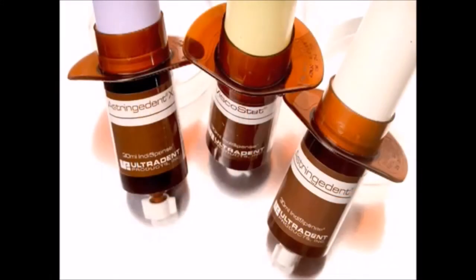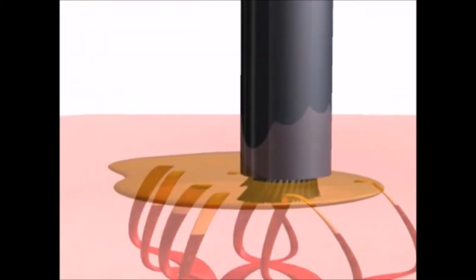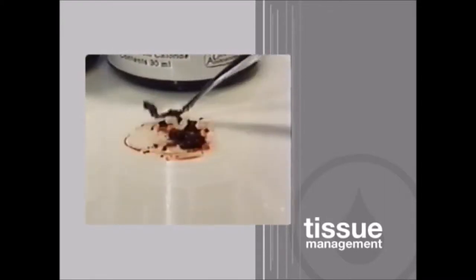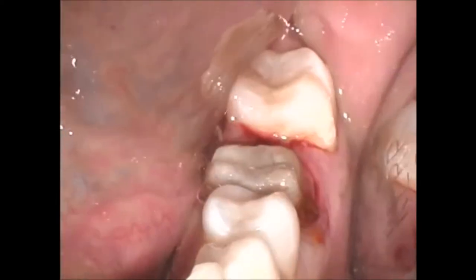Because Viscostat, Astringident, and Astringident X act so quickly to coagulate blood in the sulcus, they may prematurely tie up with blood forming coagulum before reaching the capillary openings. Then, when the superficial coagulum is rinsed away, the cut surface will again begin to bleed.